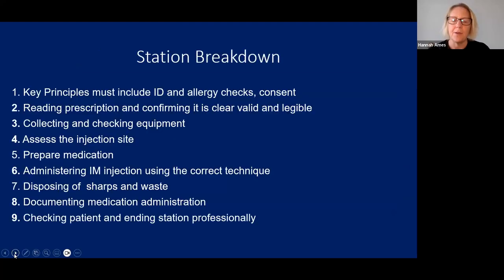And the station breakdown is the same as with our other medication clinical skills. We need to do our key principles, which must include our ID, allergy check and consent. I'm going to read the prescription, confirm it's clear, valid and legible, and collect and check all our equipment. We need to assess the injection site, making sure it's clean with no signs of infection, swelling, inflammation, etc. We need to prepare the medication using a strict aseptic non-touch technique, administer the IM injection using the correct technique, dispose of our sharps and waste, and document our medication administration. Finally, we finish the station by checking the patient is comfortable and ending the station professionally.